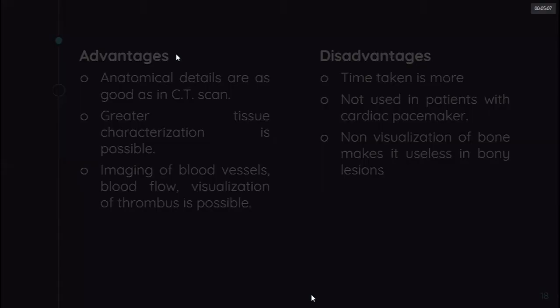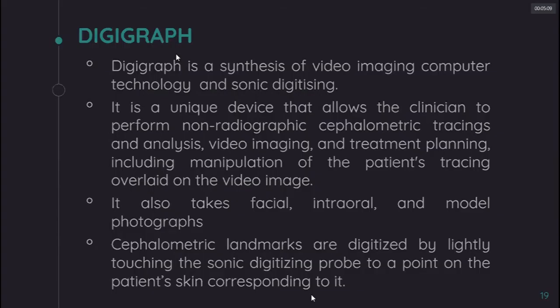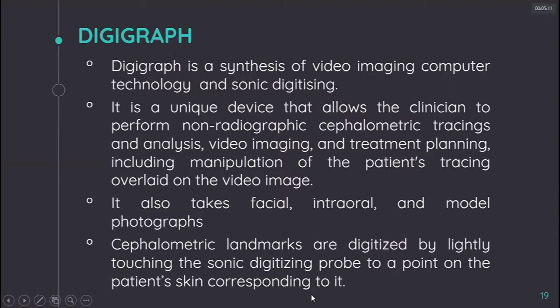Next is DigiGraph. DigiGraph is a synthesis of video imaging, computer technology, and sonic digitizing. It is a unique device that allows the clinician to perform non-radiographic cephalometric tracing and analysis, video imaging, and treatment planning, including the manipulation of the patient's tracing overlaid on the video image. It also takes facial, intraoral, and model photographs.